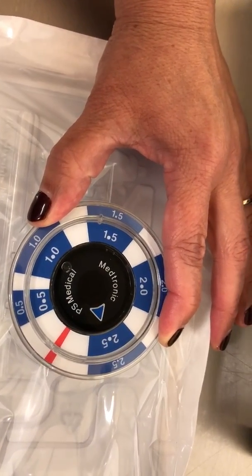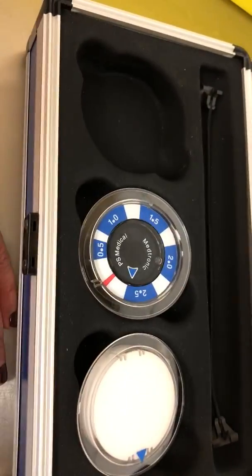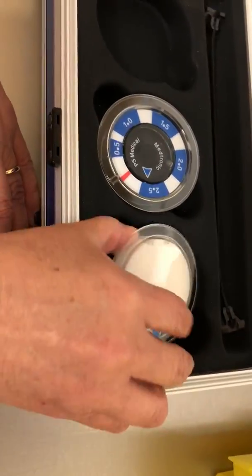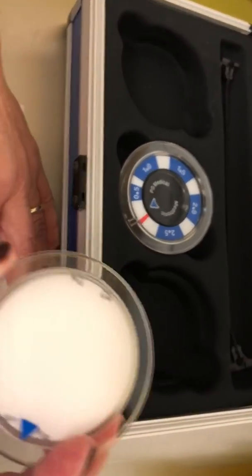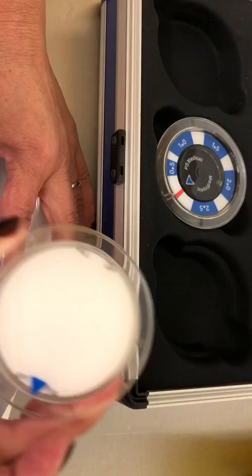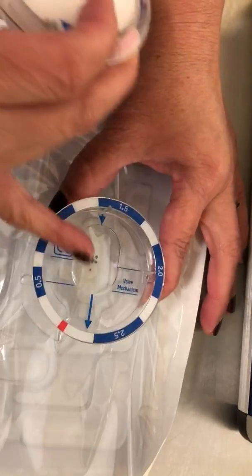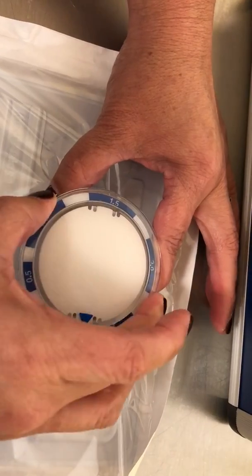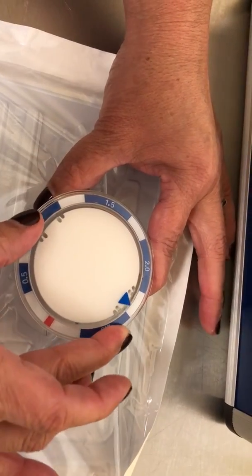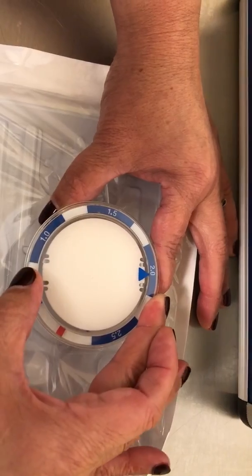So now that we know where it's at, we remove step number two and we go to the magnet, which is step number three. And let's say the doctor wants to set it at 2.0. So we align the blue line with the blue arrow and we turn the knob to where it says 2.0.